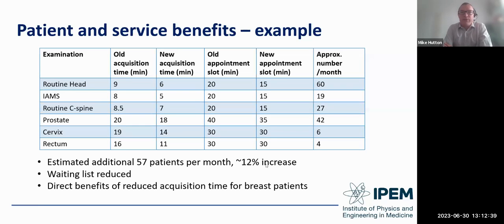And just one point to make here, and Steve may have touched on this already, around measuring the impact of AAT, and it's actually a non-trivial thing to do. So we set out thinking we could do it through looking at RIS data, but actually that's not very reliable because there are so many other factors that influence how many patients are scanned on a given day, week or month. And we found that it was very dependent on which period you compared the numbers you got.